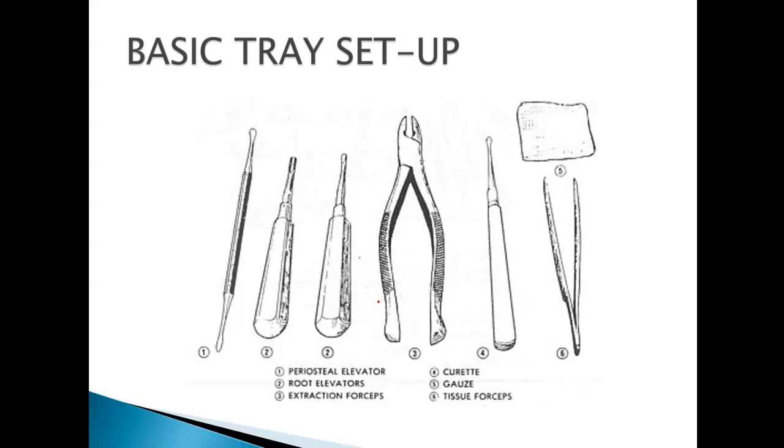His thought, which seemed to work most of the time, is that it would increase the blood flow to the socket, which would help to lubricate the area, which made extracting the tooth a little bit easier. So that was just a trick that he would do prior to any extraction that was going to be routine or simple, that we were able to use a forceps on.